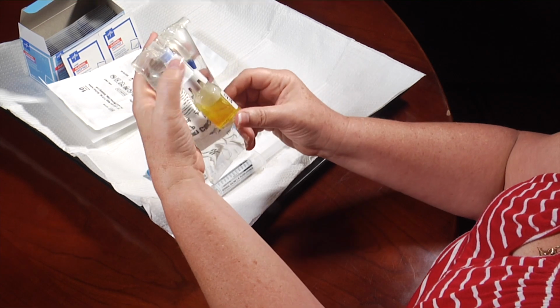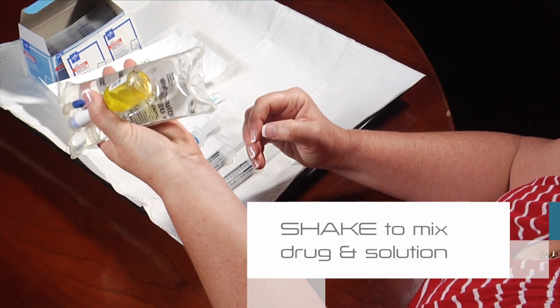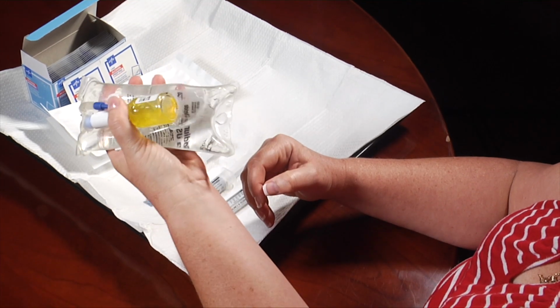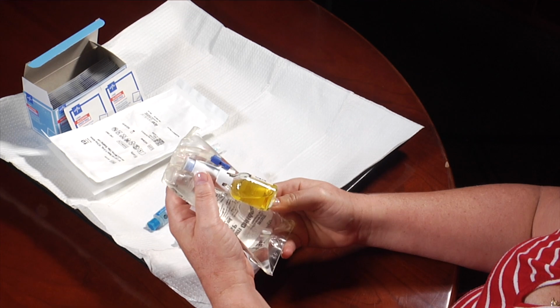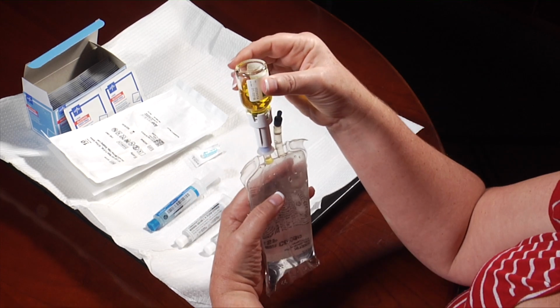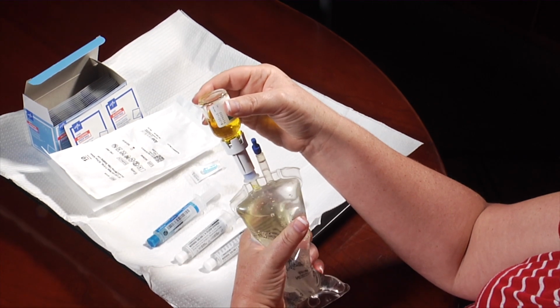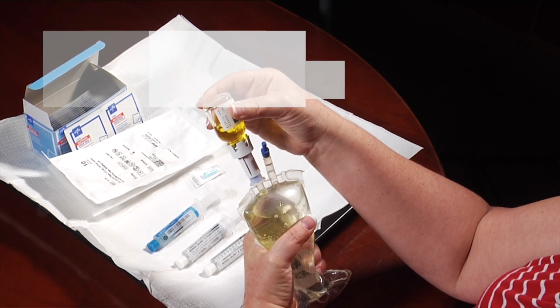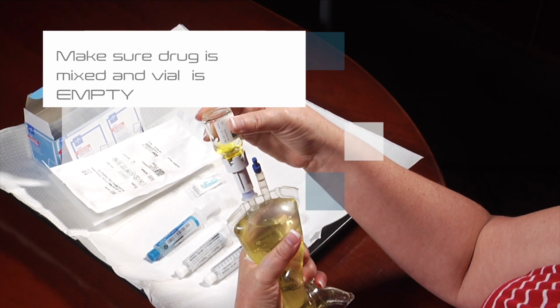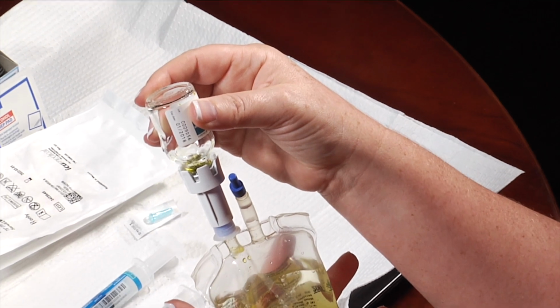Fold the vial up to rest against the IV solution bag. While holding the vial and bag together, shake to mix the drug into the solution. Hold the bag below the vial. Gently squeeze the bag to force air to bubble up into the vial. Release the IV solution bag to drain the solution from the vial. Repeat until the vial is empty. Do not remove the drug vial from the bag.